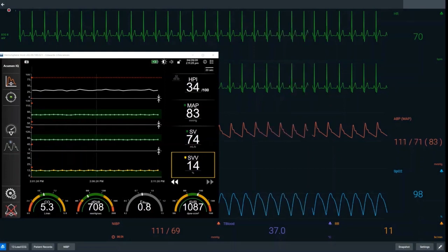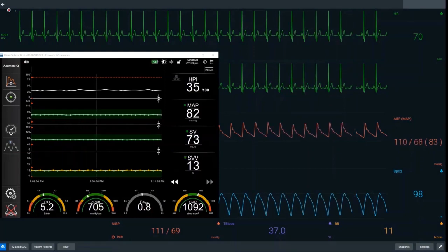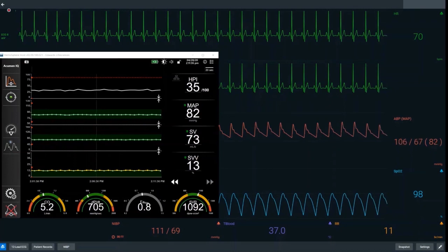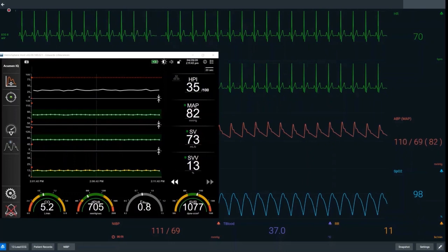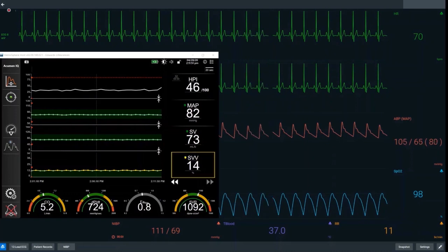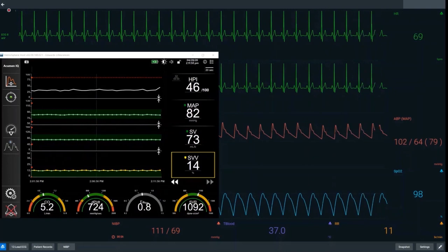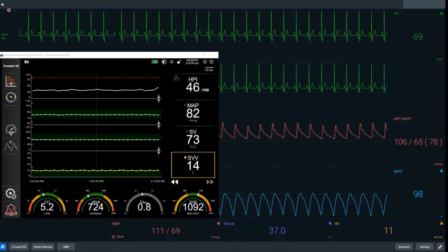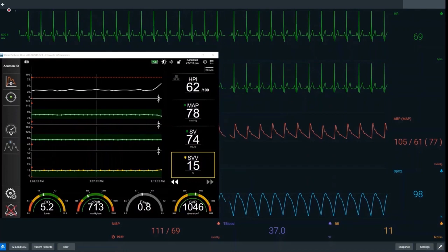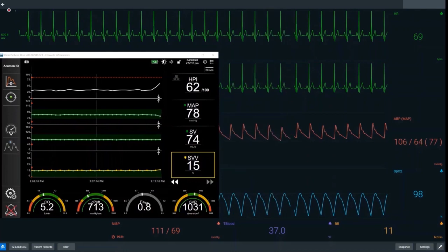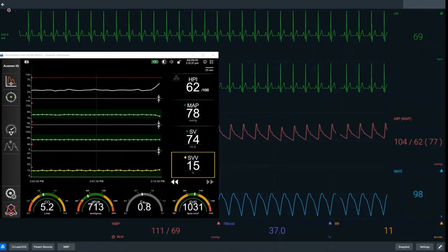Our baseline values show a heart rate of 70 beats per minute with a mean arterial pressure of 82 mmHg. Our Hypotension Prediction Index is 35. The HPI tells us the likelihood of a hypotensive event occurring in the future, defined as a mean arterial pressure of less than 65 mmHg for greater than one minute. Our stroke volume is adequate at 74 mL per beat, and stroke volume variation is slightly raised, suggesting this individual may be a preload responder.